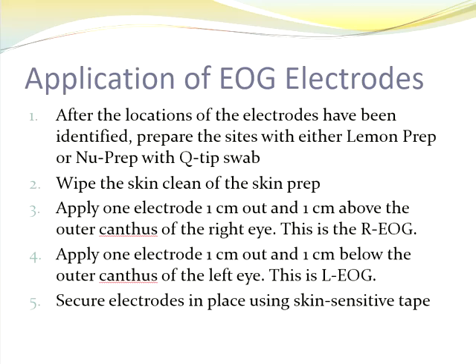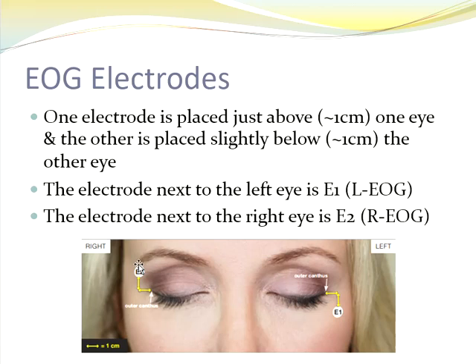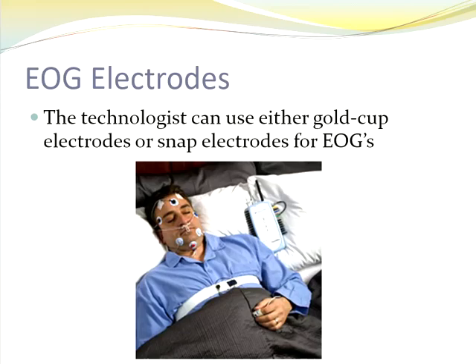Be careful when you're taping to avoid taping over the eyebrows or taping over the really sensitive hairs that are on the hairline or right too close to the eye. So this is something that's going to take practice figuring out, as you start to learn how to prepare your cart, how big of a tape you want to cut, how big of a tape that you're going to need for that specific area.